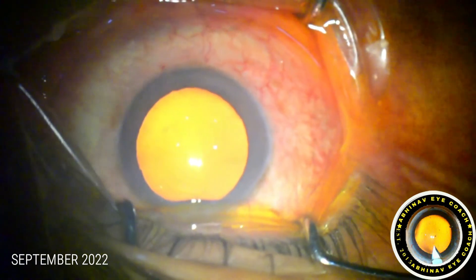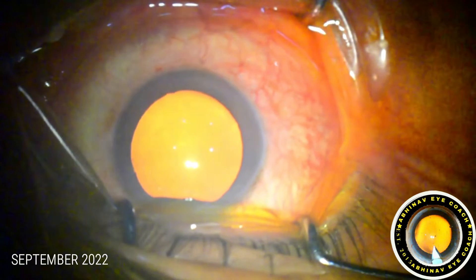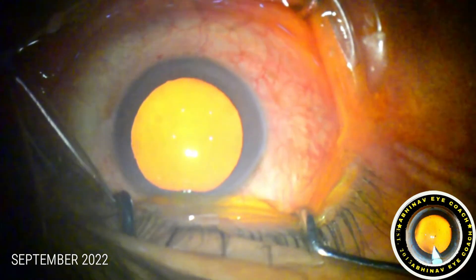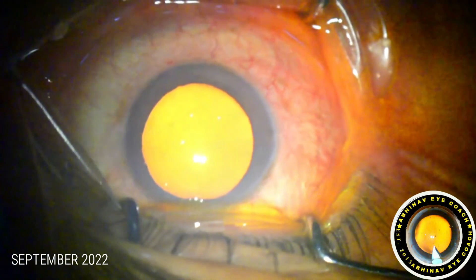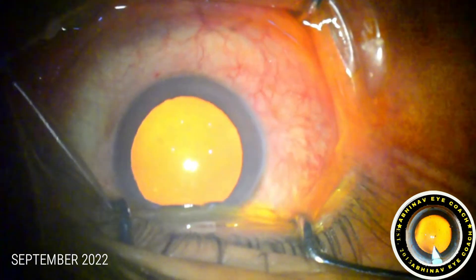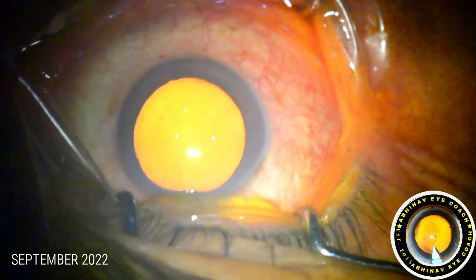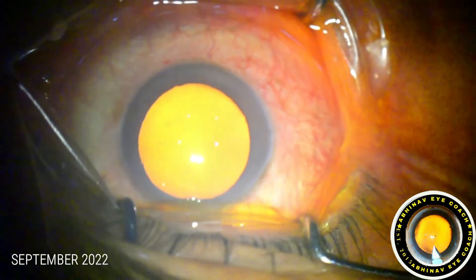The patient is asked to look at one point and not to move the eyes. This distance is then marked on the eye.